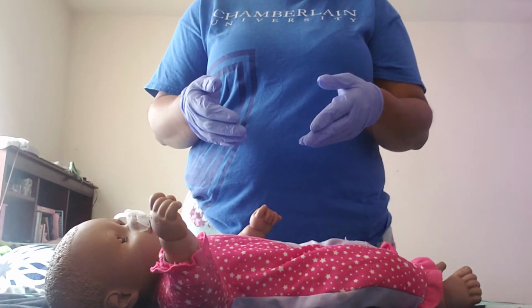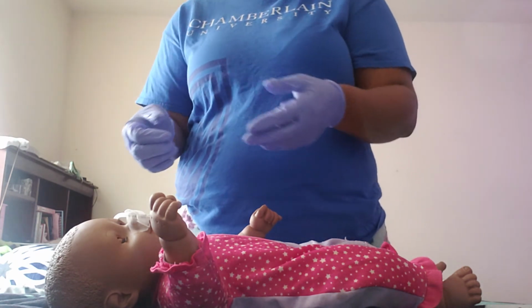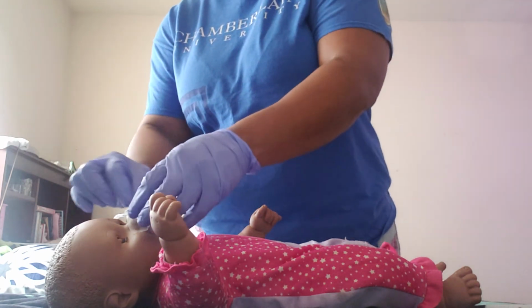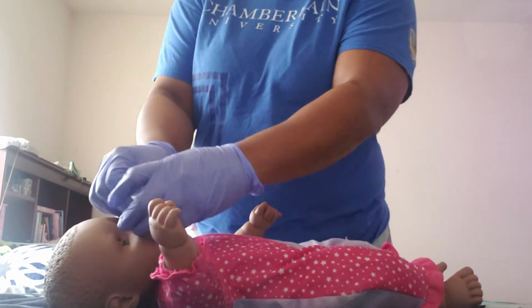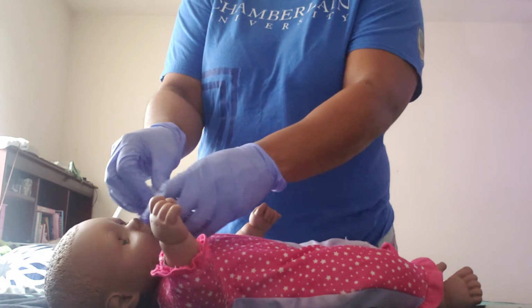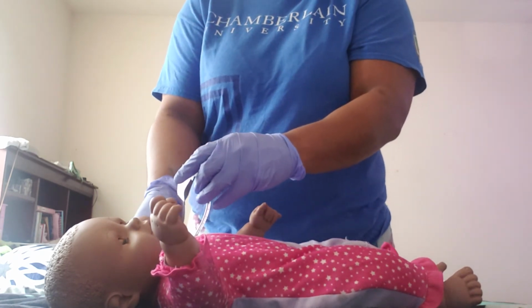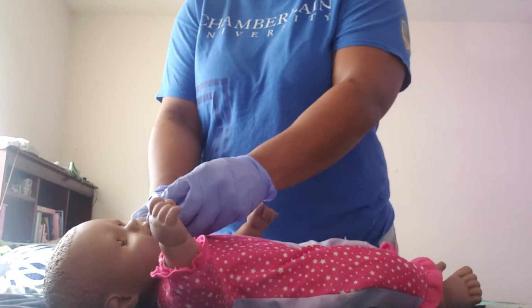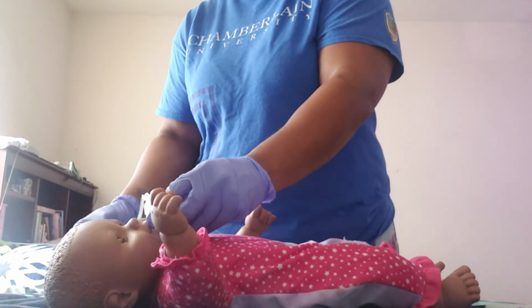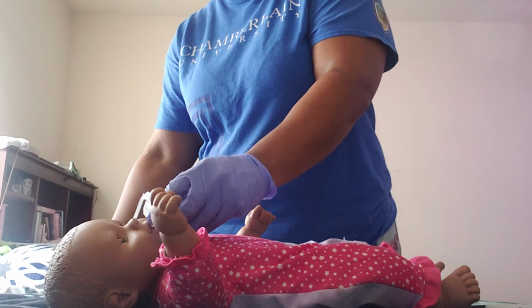And so what I will do is I will go ahead and remove the tape from the patient's nose. Okay, and then I'll detach it from the gown. Okay, and then I will have the patient hold their breath.